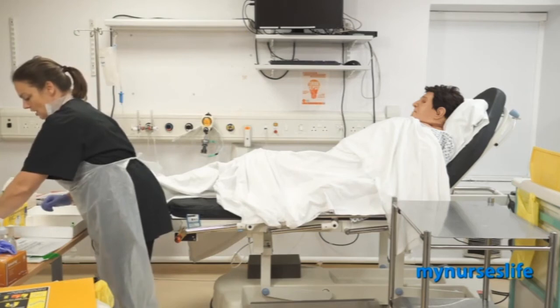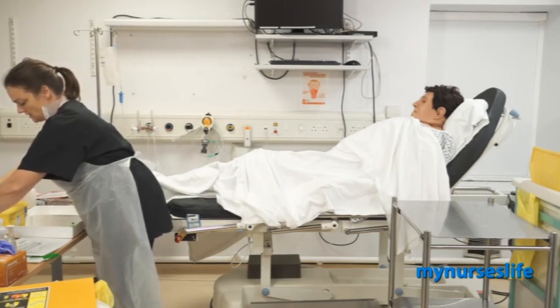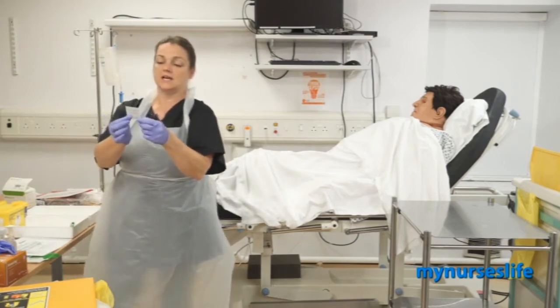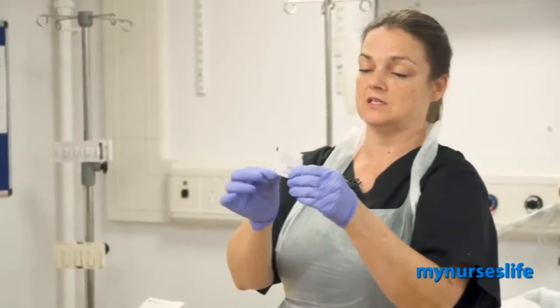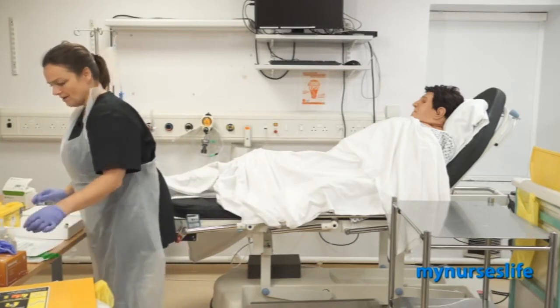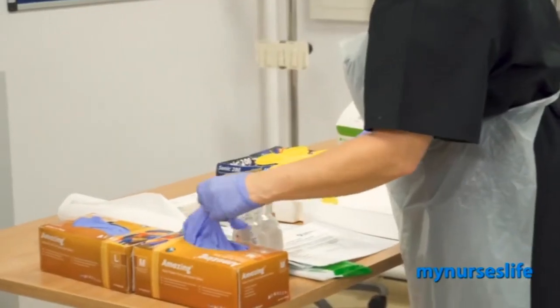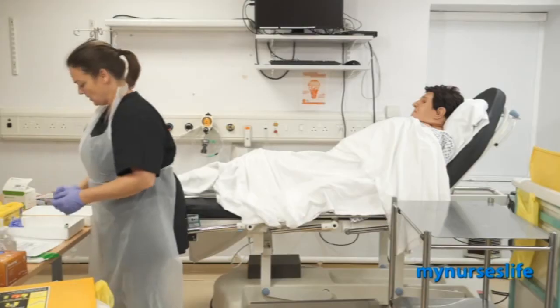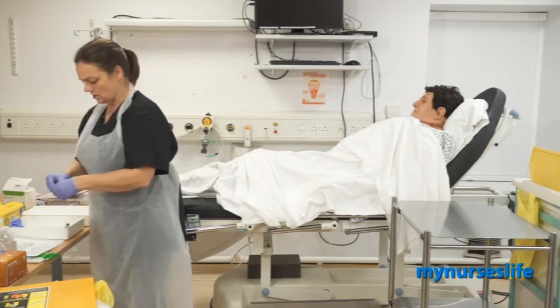I'm going to clean the top of the vial. So I'll take an alcohol wipe. So that's intact, and it's 9/20/22. So I put all those things in my tray. I will have another pair of gloves for after I've drawn it up to change my gloves. So first thing I'll do is clean the top of the vial.